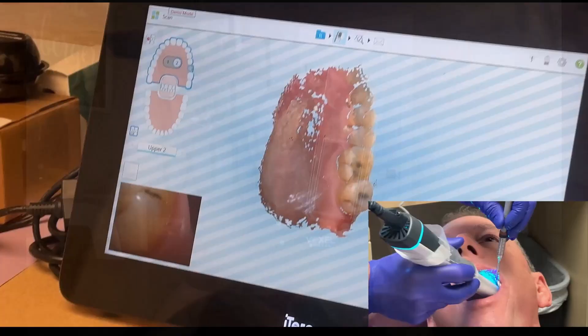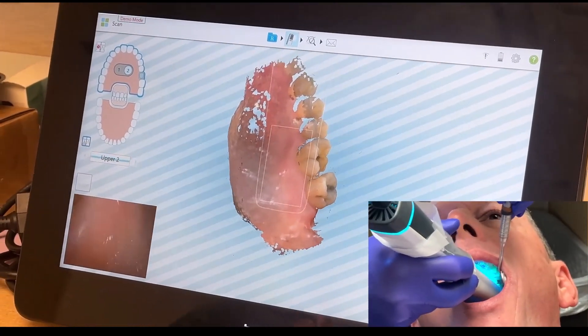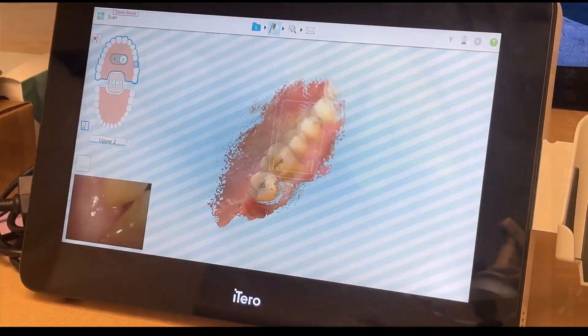What's going on everyone? Phil with Voxel Dental here with a nice little digital workflow video. This video is going to show the replacement of old amalgams to a 3D printed onlay. Everything is going to be scanned with the Itero Lumina, designed in ExoCAD, and printed on the SprintRay Midas. And the kicker is — I'm the patient.